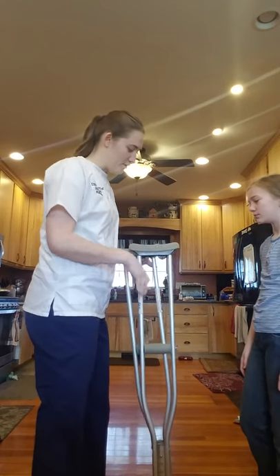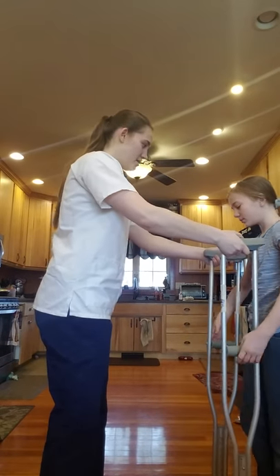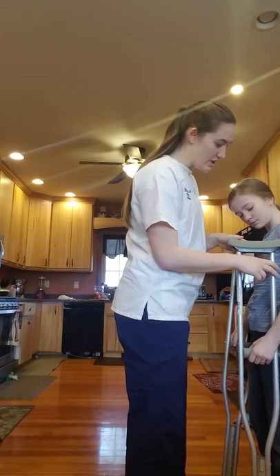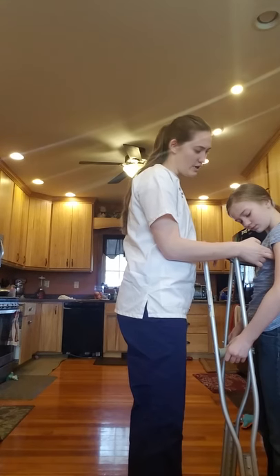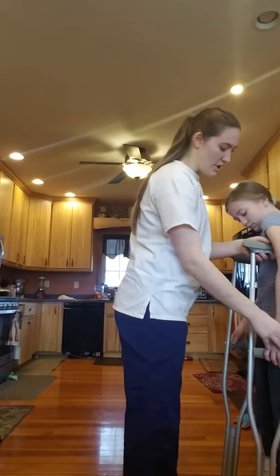Today I'm going to show you how to adjust your crutches. These crutches are a little high for you. Normally you'd want the crutch under the armpit, roughly one and a half to two inches. You'd want your arm bent a little.